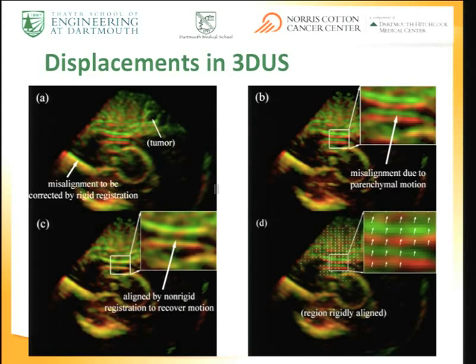And then that is re-registered. And that difference, this difference here, is projected based on that re-registration into a displacement map, a full volume displacement map that we can then use in our modeling strategies to try to estimate the updated MR, as we like to call it. So coming back full circle, and I've still got a few more minutes and a few more slides here, so that'll work out well.